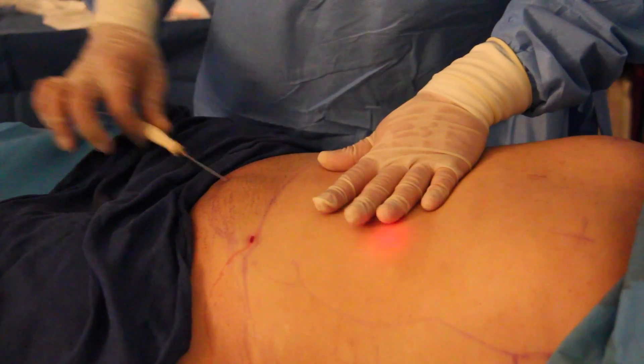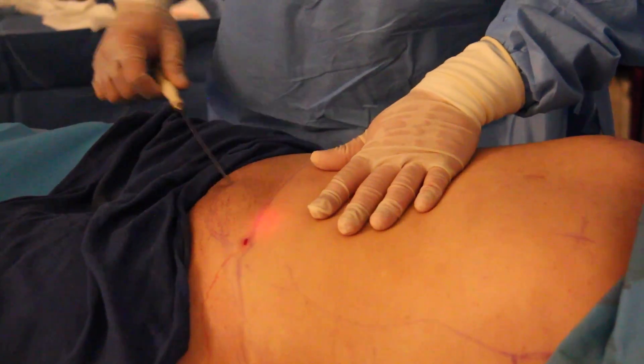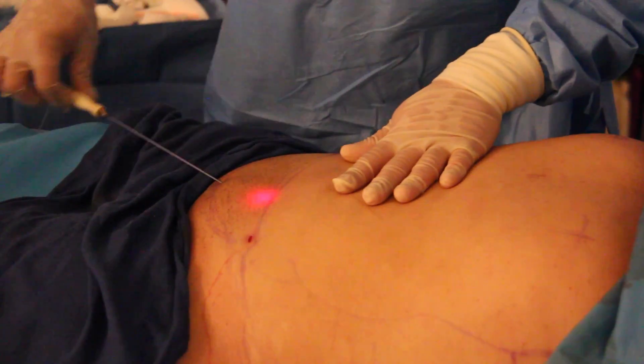This procedure helps break down the fat cells as well as tightening of the skin.